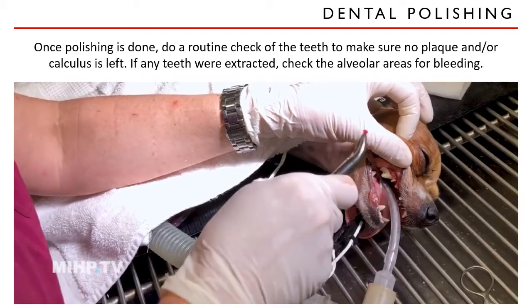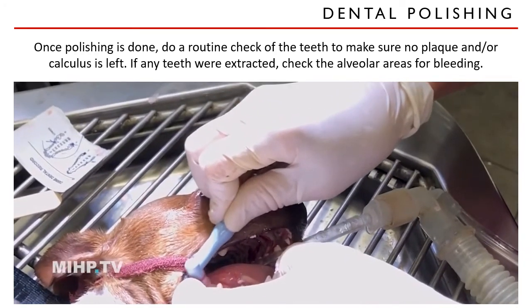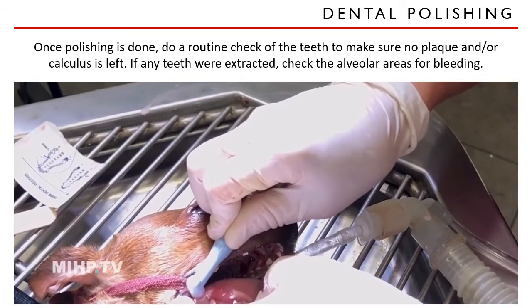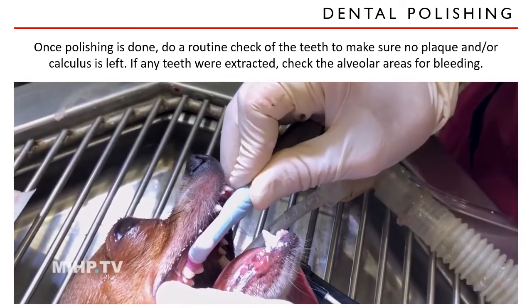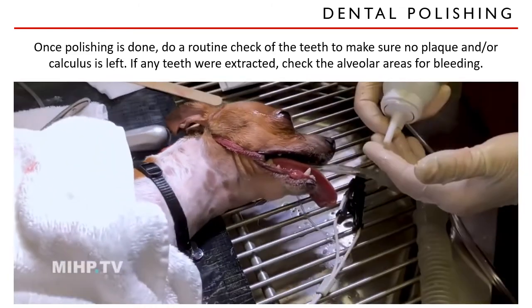Let's watch this video and see how polishing is done. This is polishing the teeth after scaling, just to smooth out any grooves left in the teeth from the scaling. Bacteria can grow in the grooves if you don't smooth them out. And we're going to put on a little fluoride.